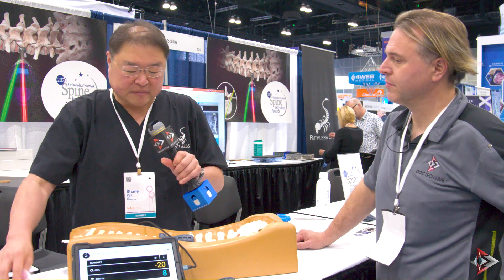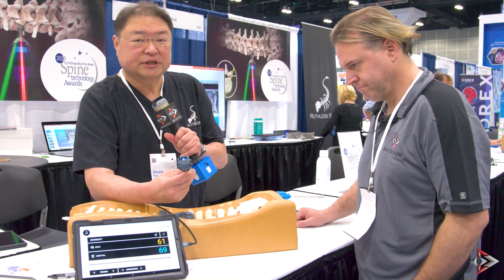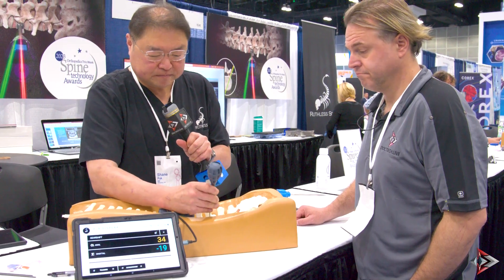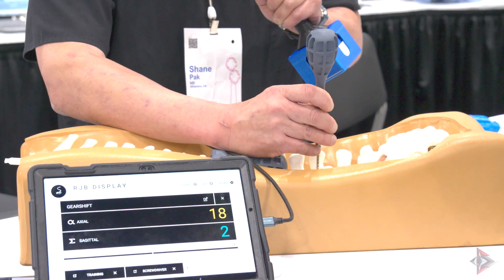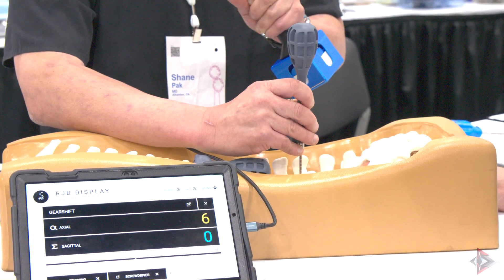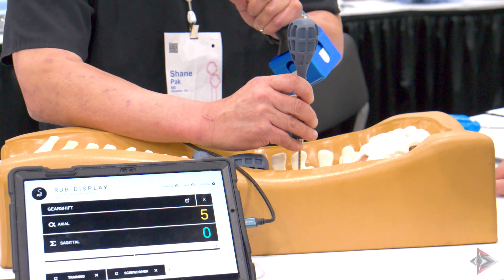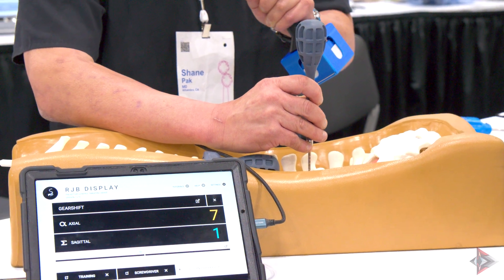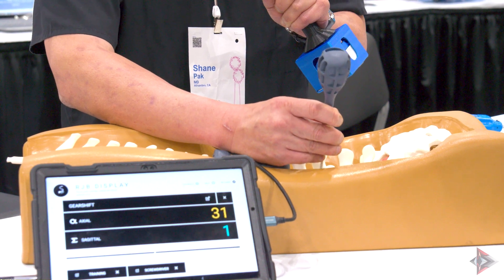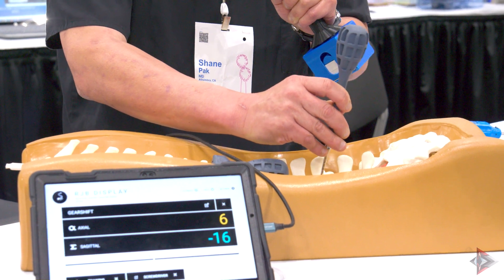The module slides into these instruments that are modified, that are RJB compatible. You can see a module inside this gearshift link key. As you move and angulate the gearshift, it will change the displayed angle. The gearshift treats straight up and down as 0, 0. As I tilt the gearshift axially, it'll change the axial angle, and as I tilt it sagittally, it'll change the sagittal angle.